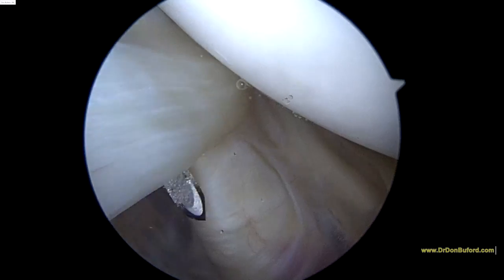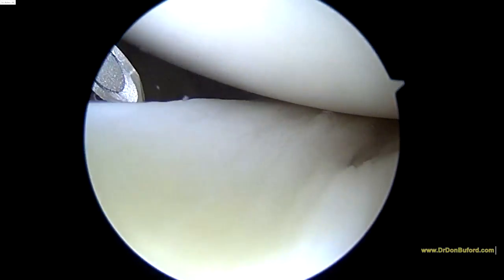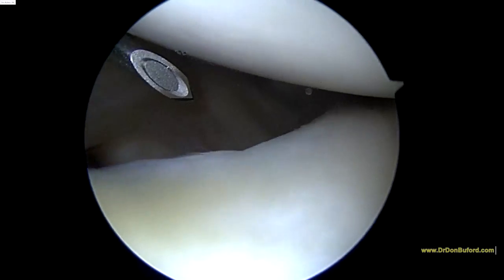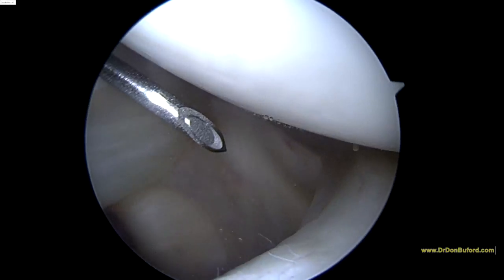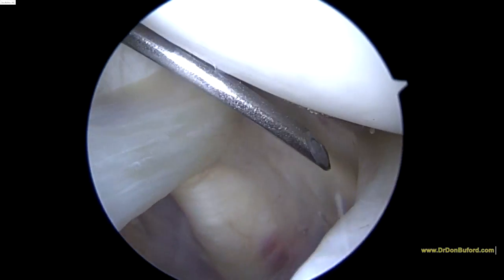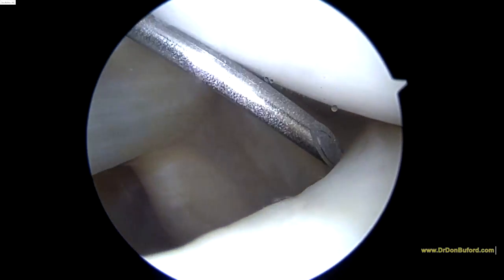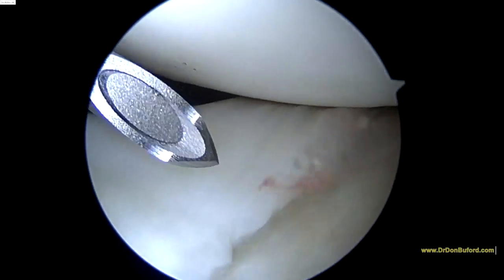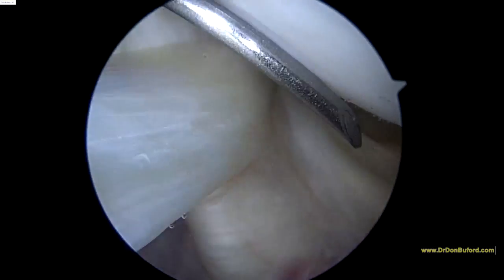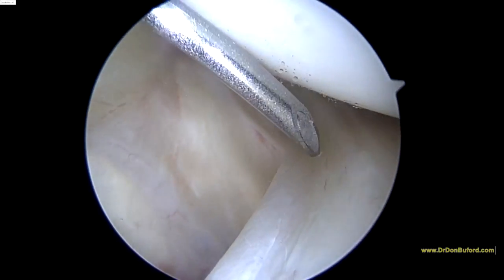Now down below we will see the inferior glenohumeral ligament. So here's the middle glenohumeral ligament. Paralleling it, but more inferior, is the inferior glenohumeral ligament. This is the labrum, the IGL, or inferior glenohumeral ligament — it's this fold in the capsule right here.